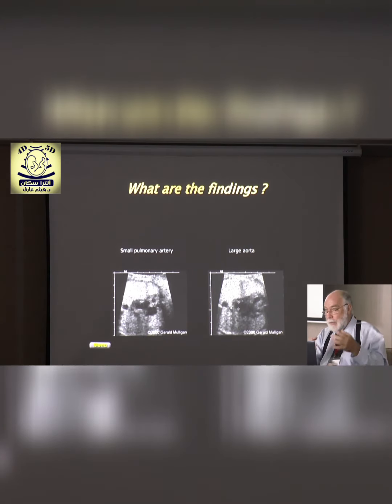And you're going to say, "Well, we have some cardiac surgeons here, and they can repair them, and the prognosis is going to be pretty much okay," or "the prognosis is not very good." What do you tell her? Tetralogy of Fallot is very common, huh? Most cardiac centers can repair tetralogy of Fallot. So you tend to say, okay, it's pretty much okay.